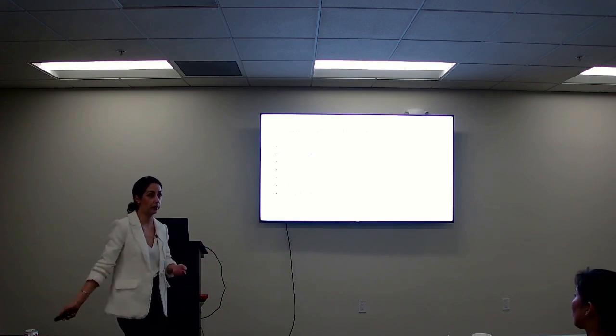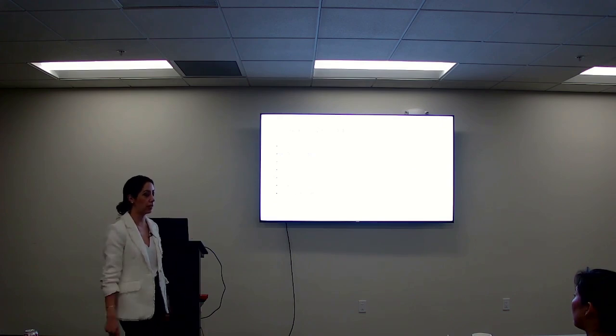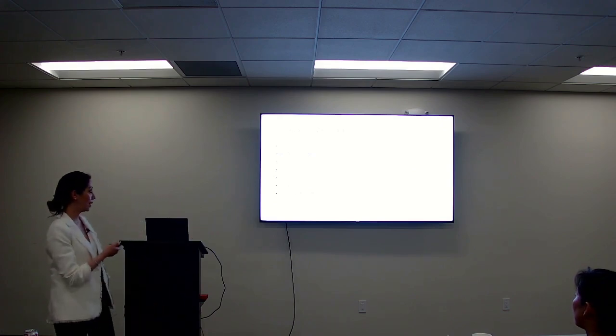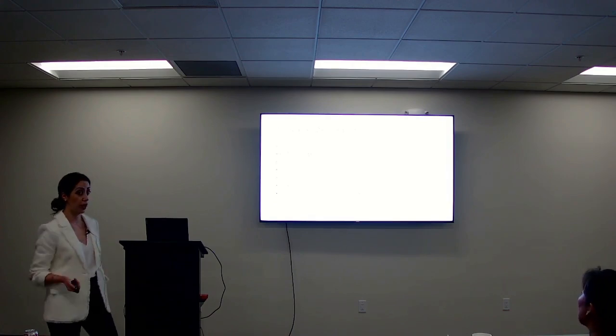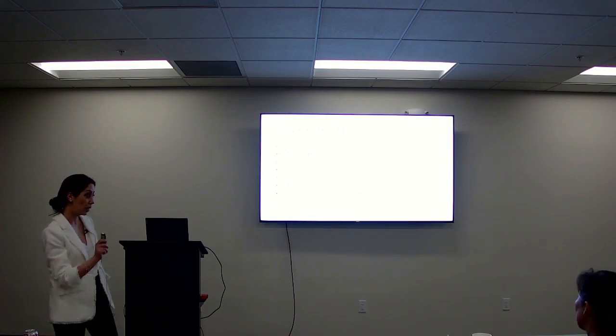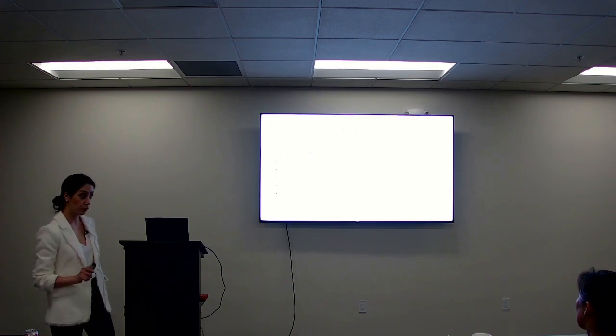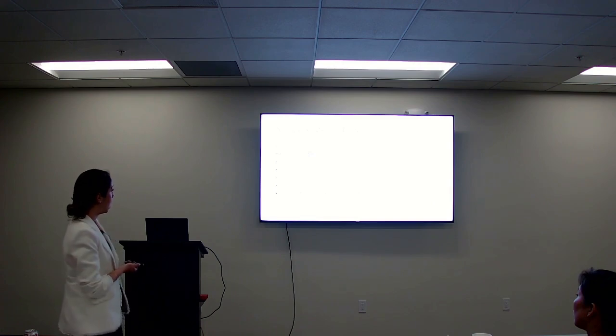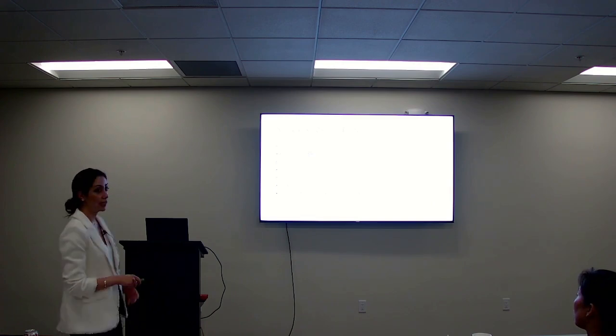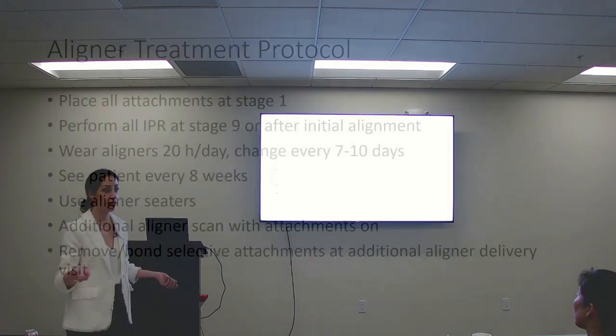changing every 2 weeks is also harder to keep track of than weekly, because every Thursday I'm going to go to the next one. Easy to remember, right? So I tell them I'd rather have you change them every 7 to 10 days, even if you're not getting the optimum hours, but don't go to 2 weeks because they also get lazy. You lose momentum. So use aligner seaters, the little chewies, munchies, crunchies, whatever they're called now.